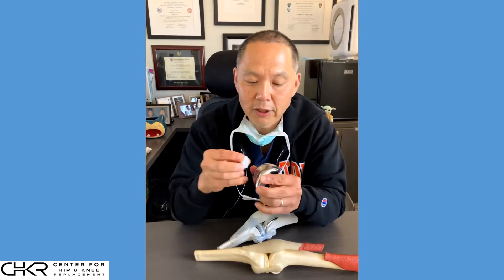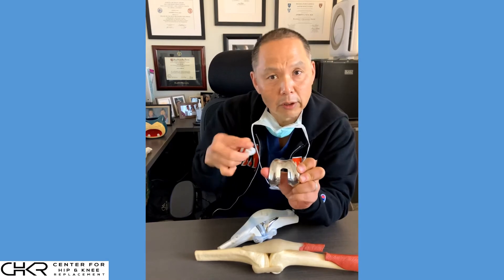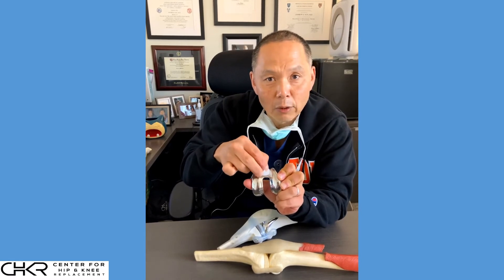This polyethylene button will then articulate, or track, with the groove — what we call the trochlea — of the femoral component. So when the knee is flexed, the bones will glide rather than grind.